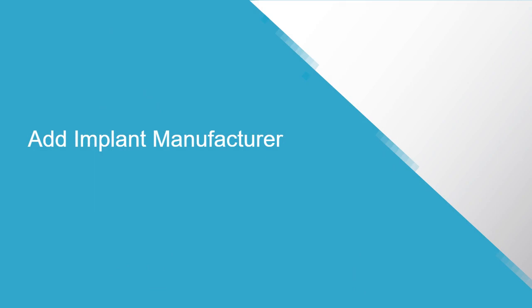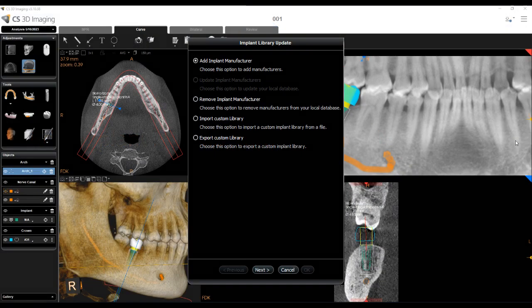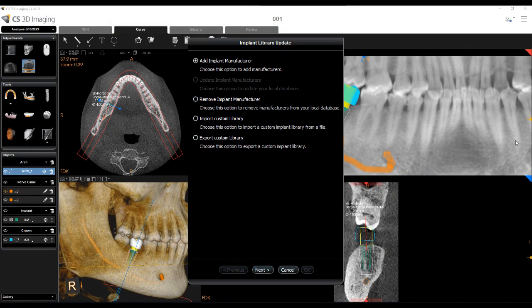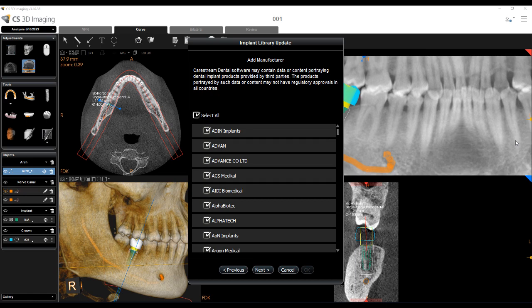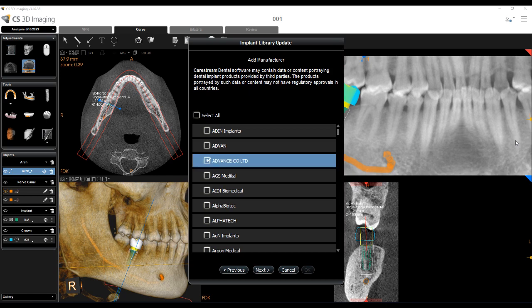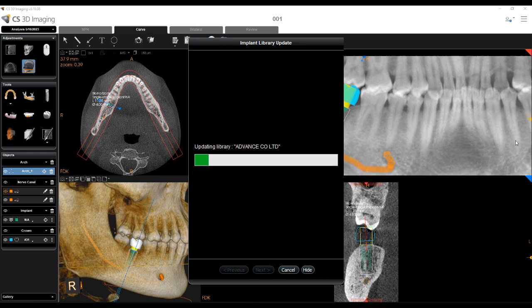Add Implant Manufacturer: Select Add Implant Manufacturer and click Next. A list of available implant libraries not currently installed on your computer is displayed. All manufacturers are selected by default. Deselect the manufacturers you do not want to download and click Next. Click Hide if you want to perform the implant update in the background while you carry on working. Click OK to finish, or Previous to return to the options menu.